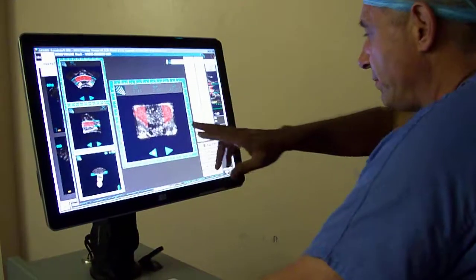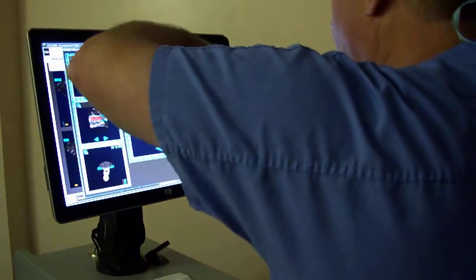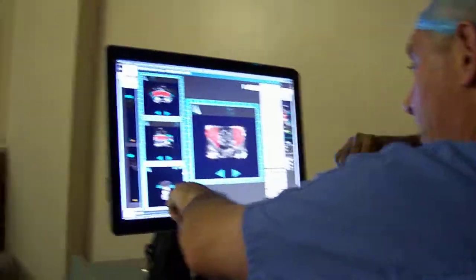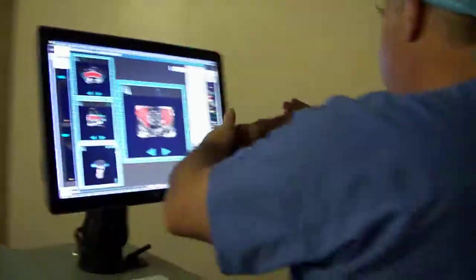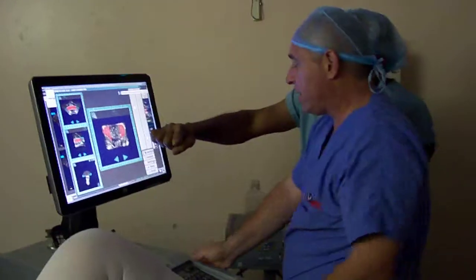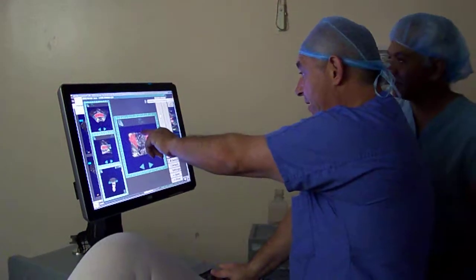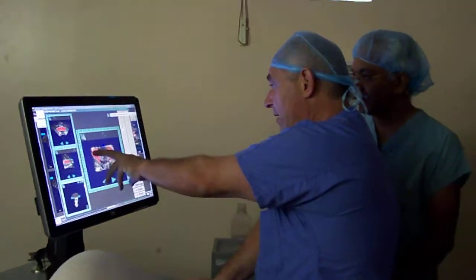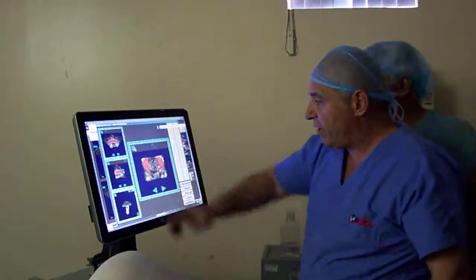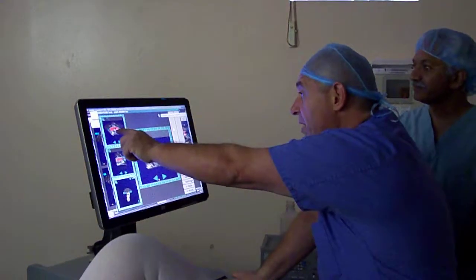Now right here, you're posterior to the corona plane. Apex, base, and we're taking an image coronally. The prostate is like this. We're coming through here, like so. If the plane is through here, the apex is here and then the base is down low there. This is the coronal plane, right through basically just below the middle of the treatment zone, right through here.